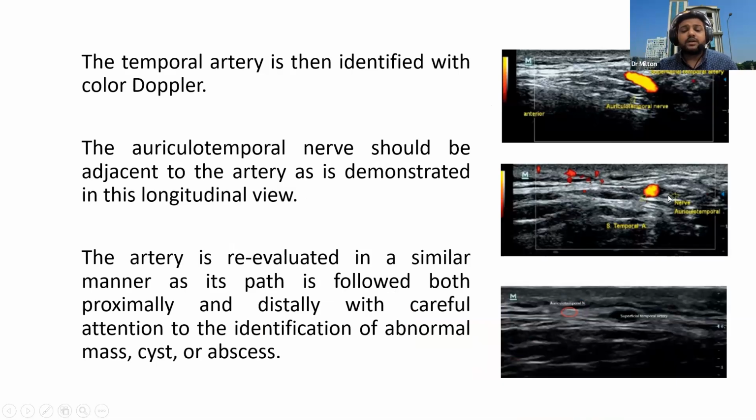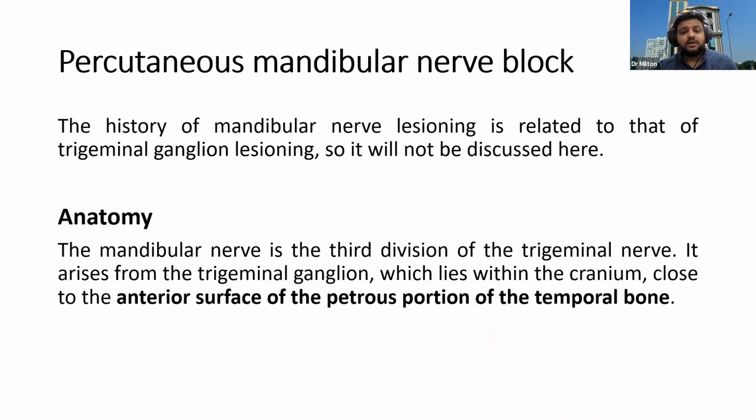So you can give the injection in plane and out of plane, both. Okay, so now the mandibular nerve block. Sir has already shown the anatomy, so we can see how we can identify the mandibular nerve.